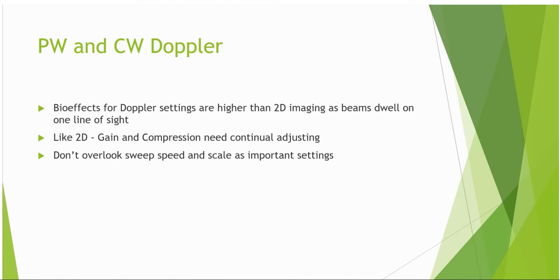Also consider we may have technology available to us that makes life easier. Your PACS may have the ability to perform measurements on stored images. A point-and-click method for a VTI trace is significantly faster, easier, and more accurate than trying to attempt a trackball trace, regardless of whether your dominant hand is used or not.